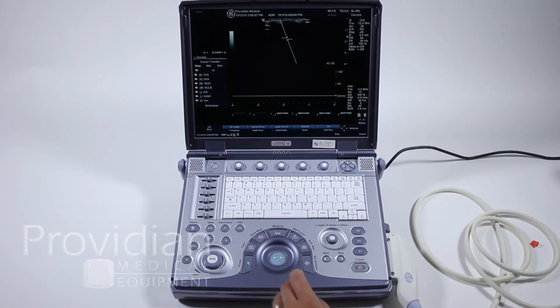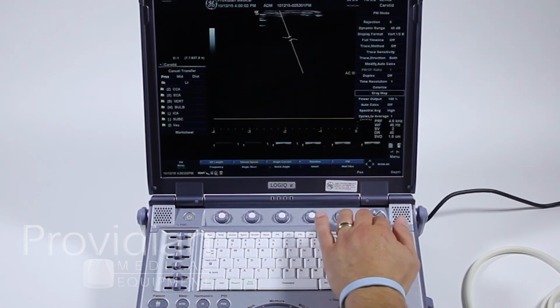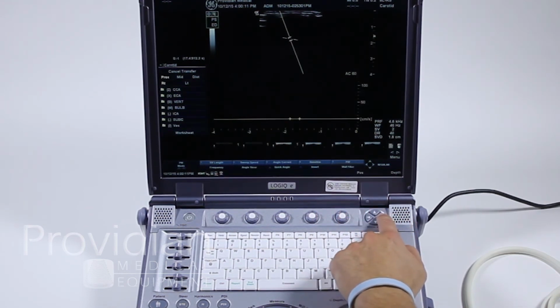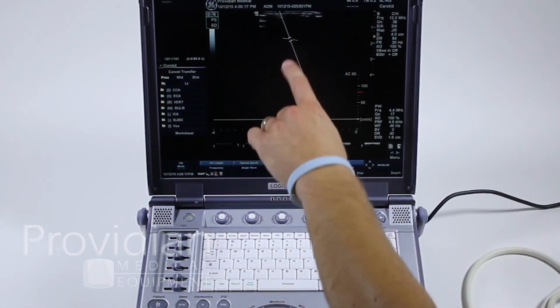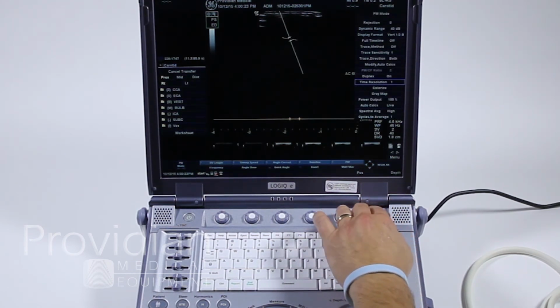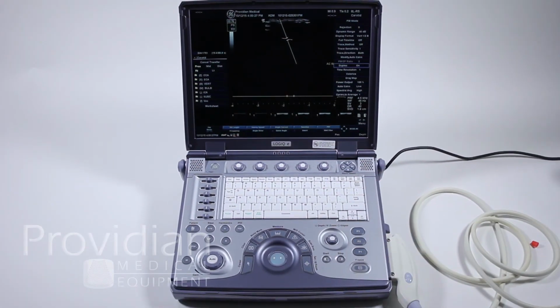You can also activate the auto calculations by again selecting this. And you'll see down at the bottom, you can flip it on to frozen, live, and you can go through that way. If you want duplex imaging, you're going to turn duplex on and off. So you'll get the live image up here, the live 2D and the live spectral Doppler. Again, that's here. If you want triplex, that is in the system setup, where you'll click on for duplex and it will show up there and allow you to do the triplex imaging.